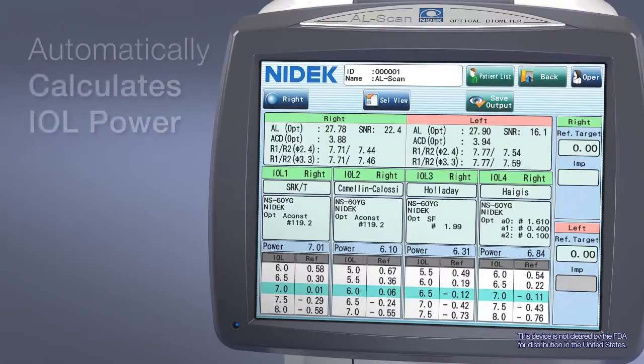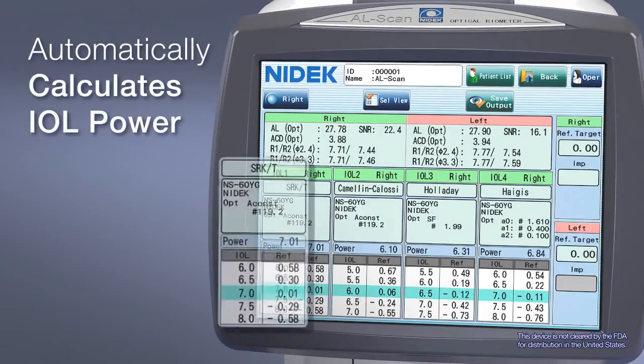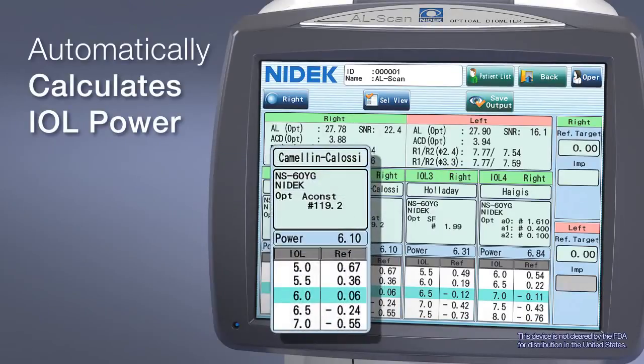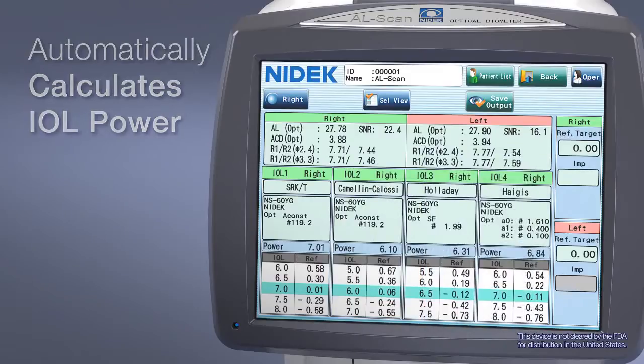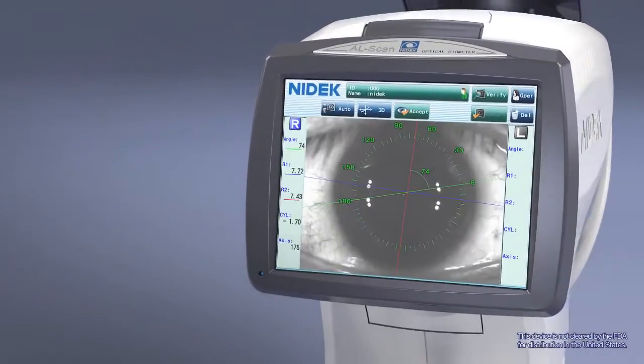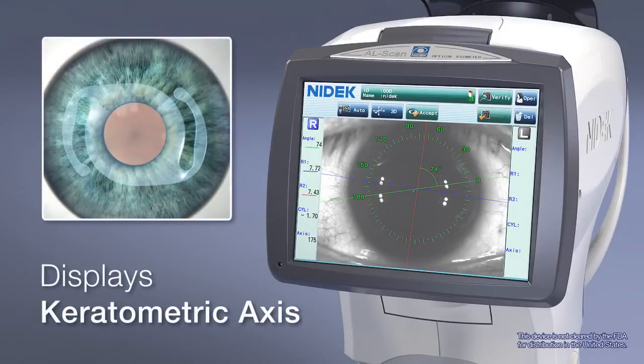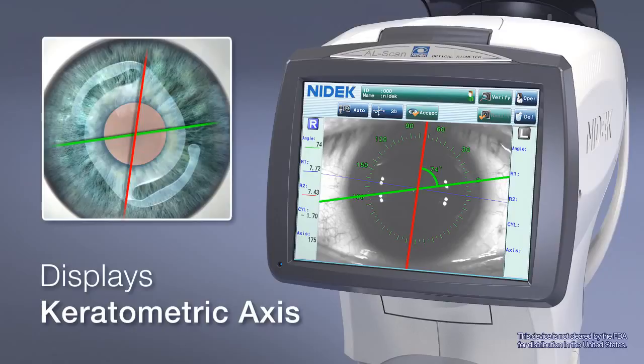The AL-Scan automatically calculates the optimal IOL power using its own measured data without the need for additional equipment. In addition, the keratometric axis is displayed on the eye image to assist with toric-IOL alignment.